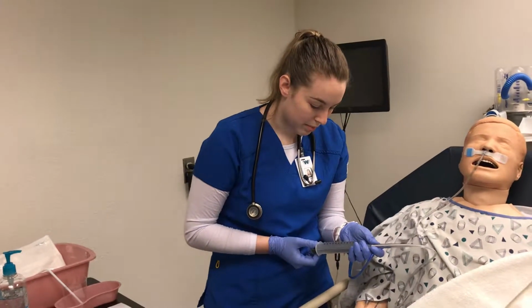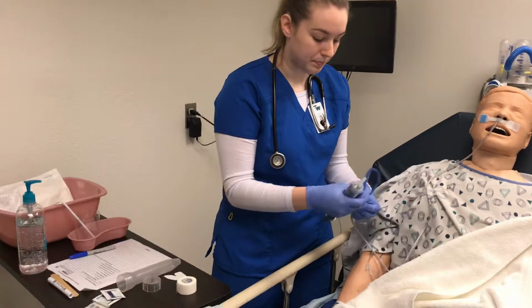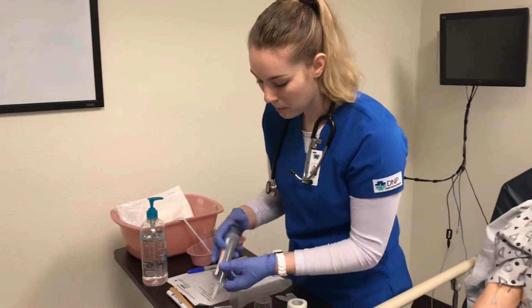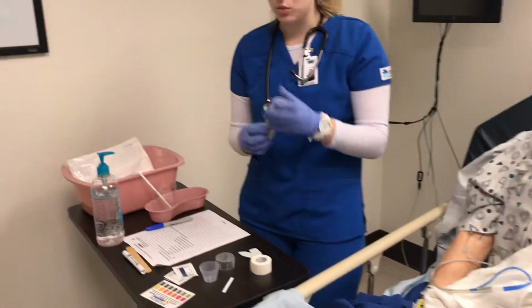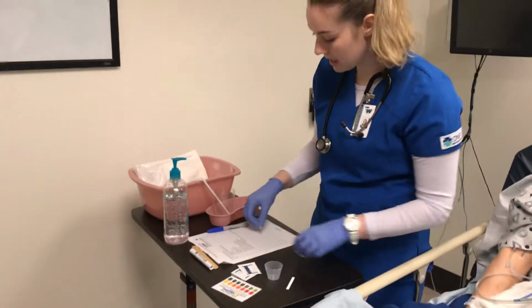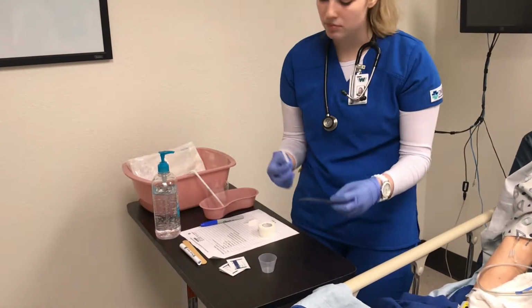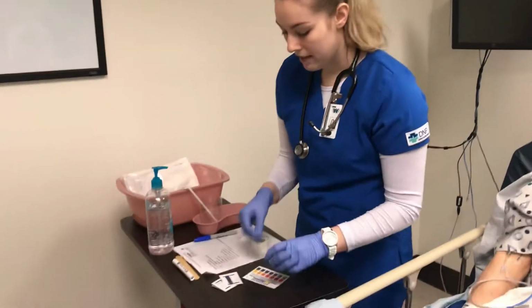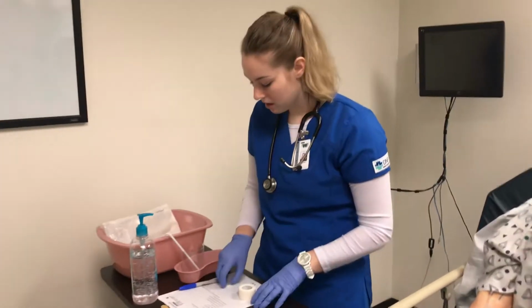Okay, and then I'll just withdraw some gastric fluid. And then I will put it into my medicine cup. And then depending on whether this needs washed or disposed of, I would put it in a biohazardous container or whatever facility policy is. And then I will dip my pH strip into the contents and I will compare it on my chart, which it looks like it's about a 3, so that's normal. And then I would dispose of this as per facility policy in a biohazardous container.